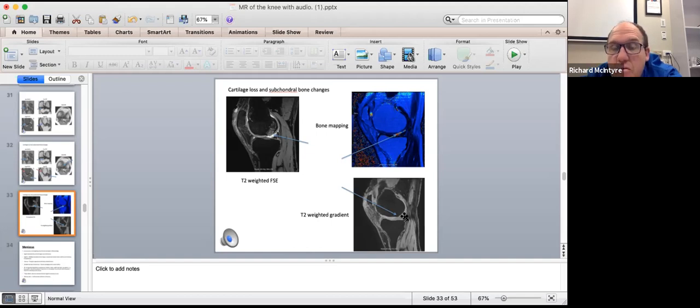Okay, probably not the best example, but you could imagine if that synovial fluid was even brighter. Okay, you would imagine if we did a T1 and we injected it with intra-joint contrast, I can't remember, arthrogram contrast, that synovial fluid would be bright.